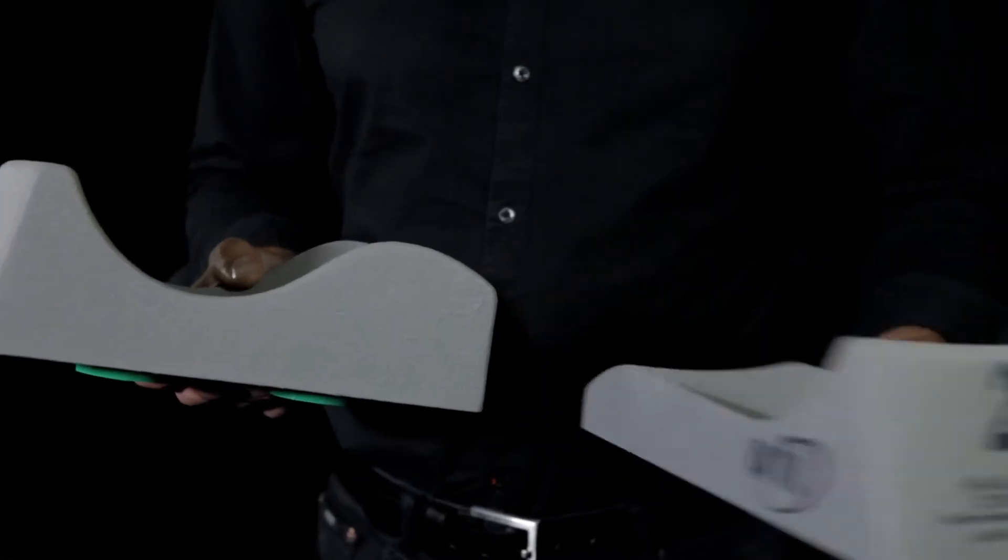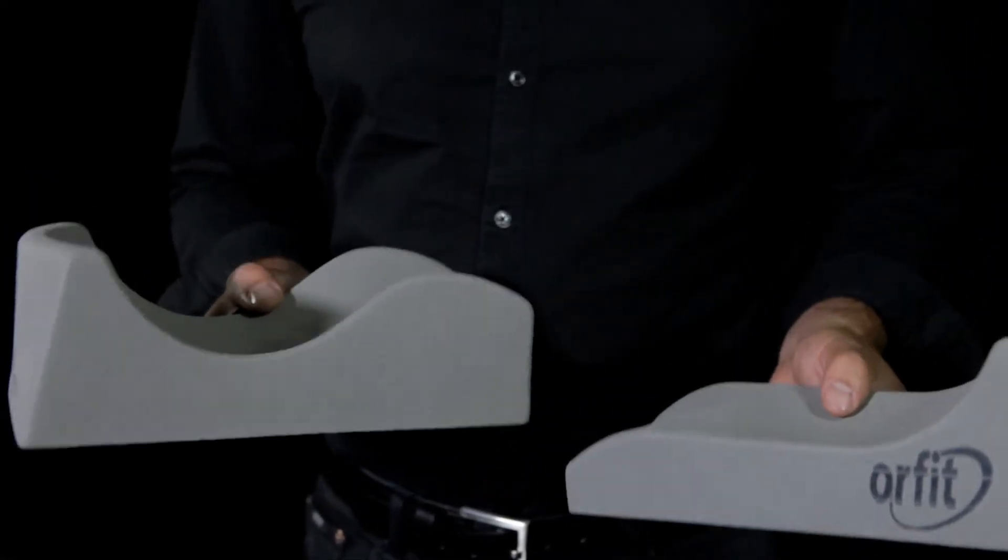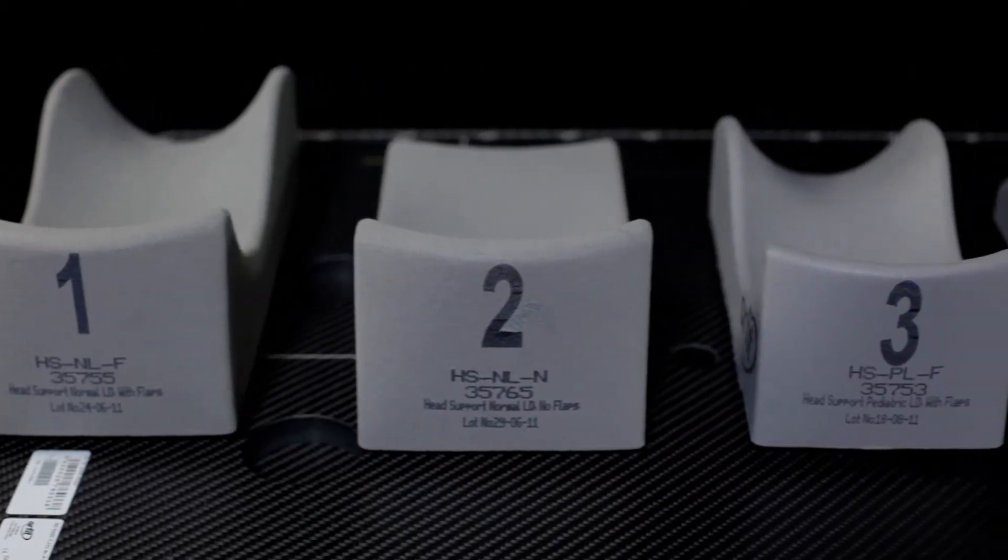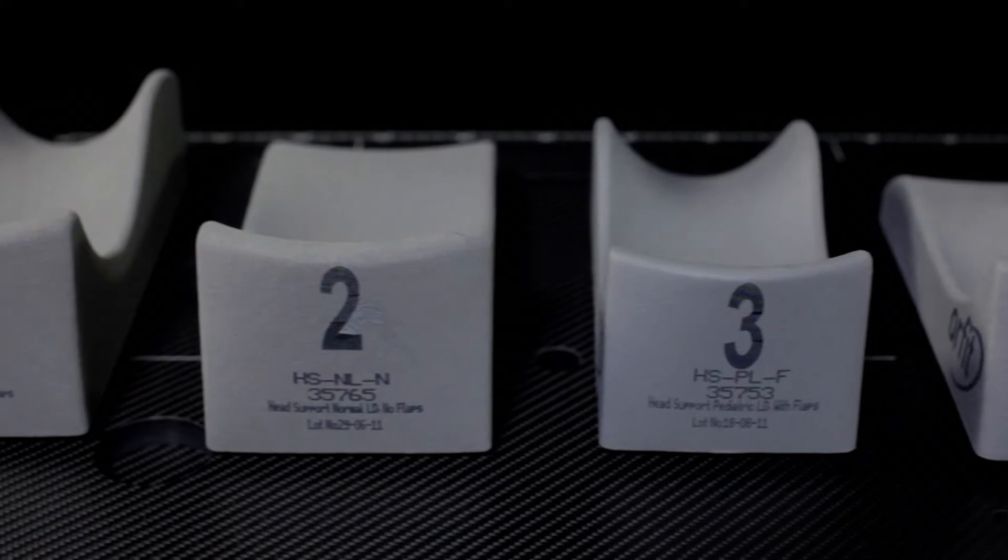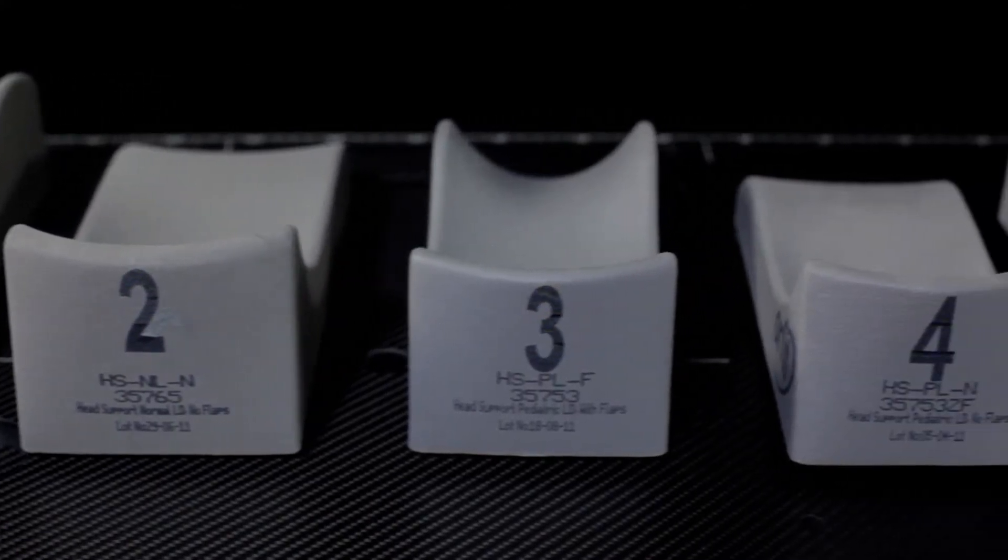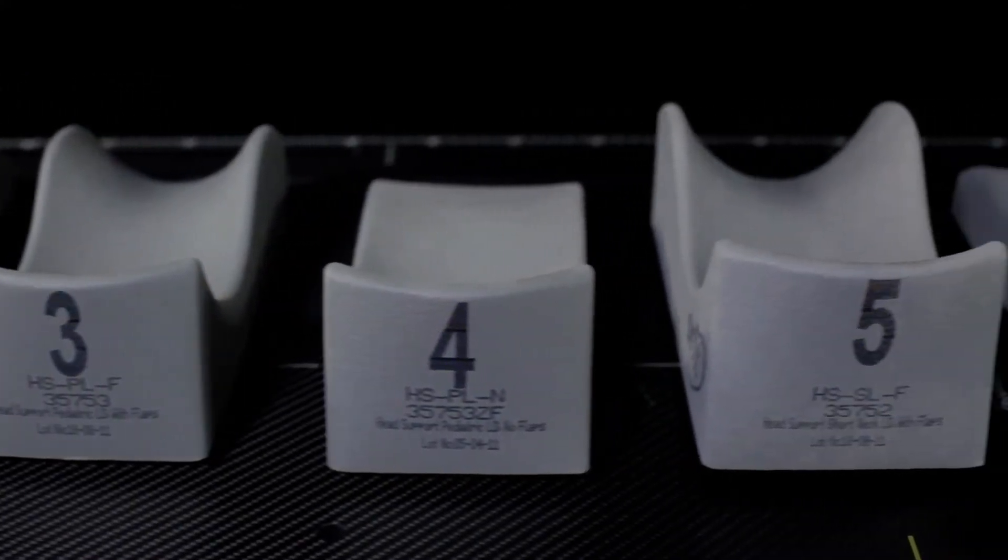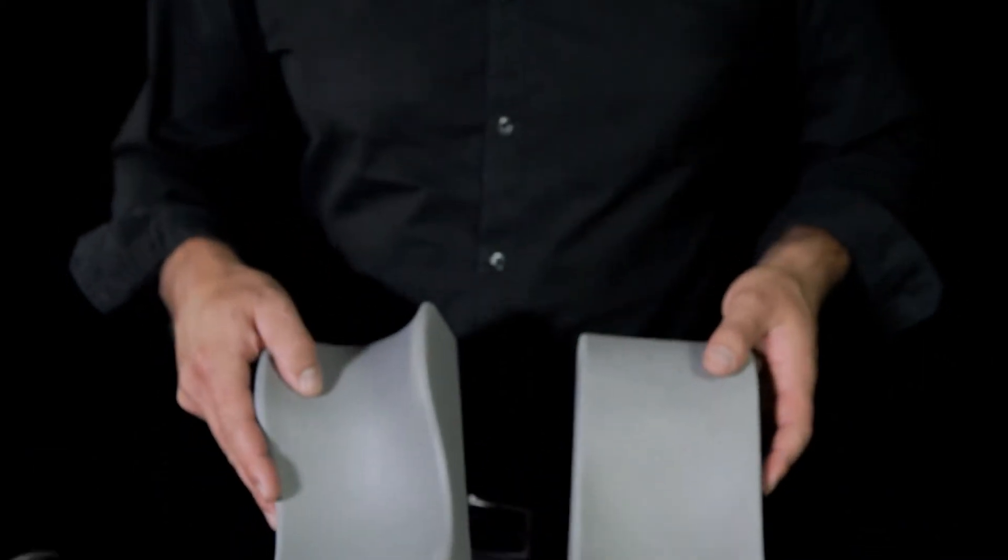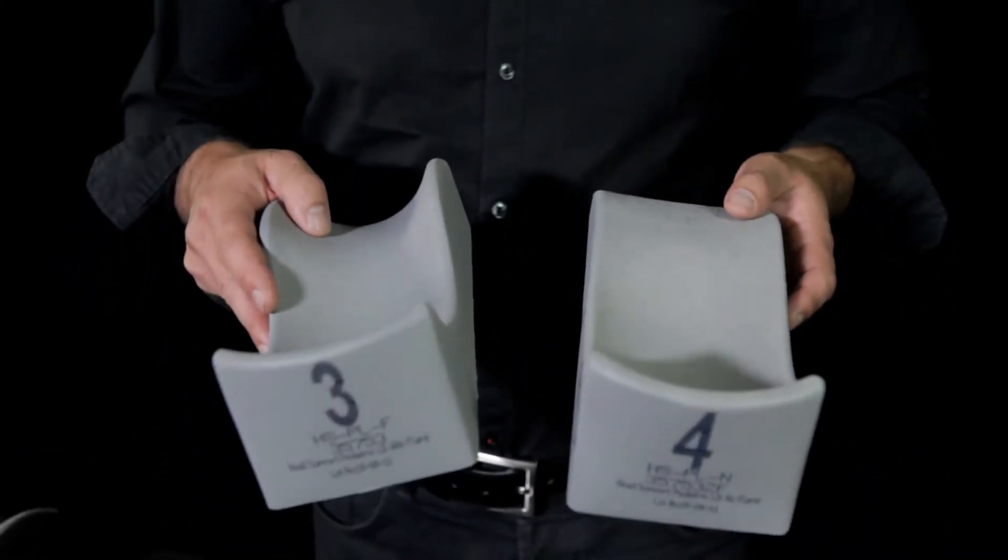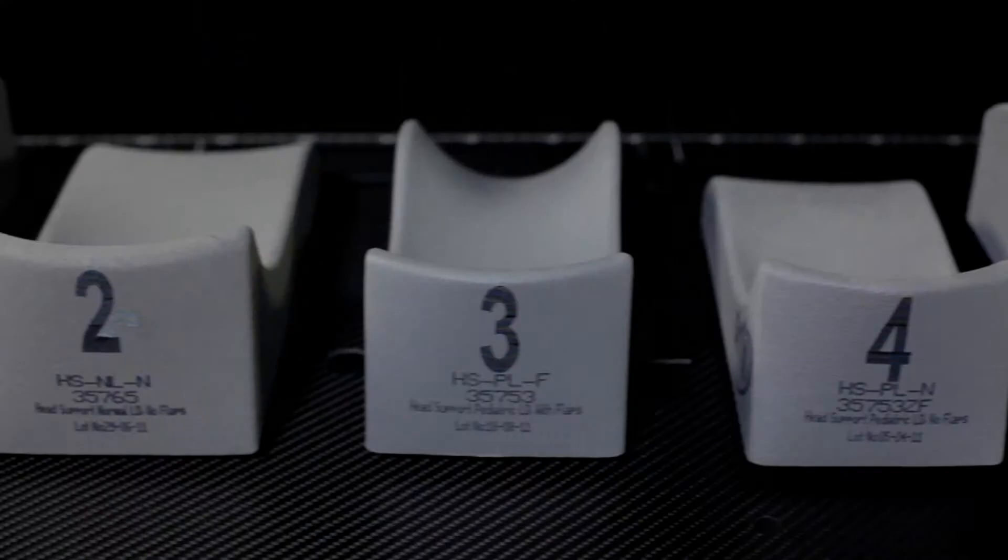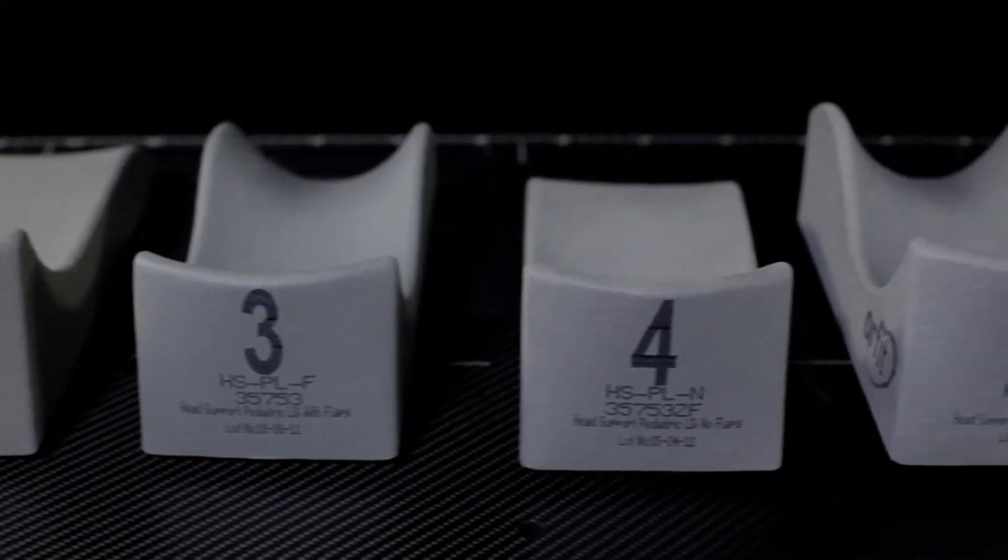Support 2 differs from head support 1 because it doesn't have lateral flaps or supports. Head supports 3 and 4 are the standard pediatric models.